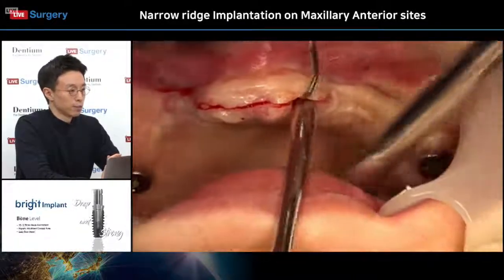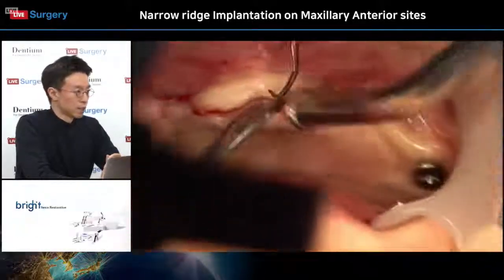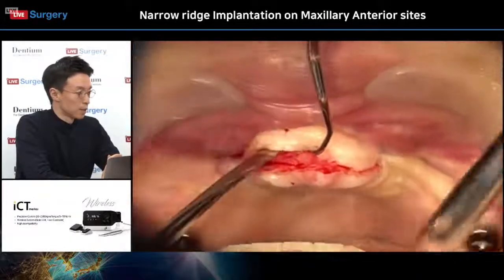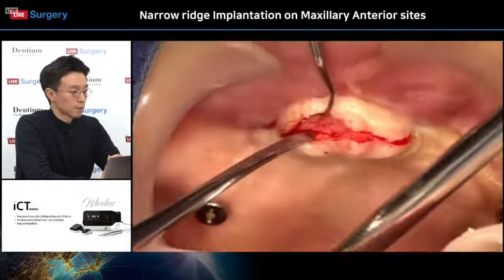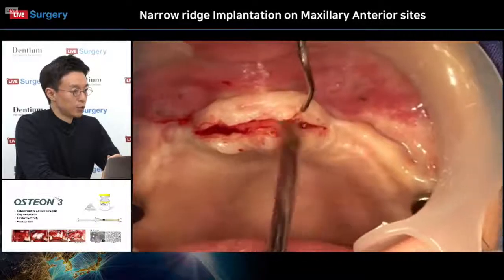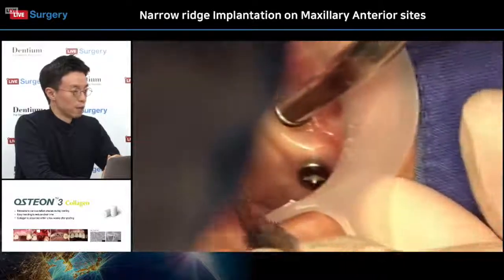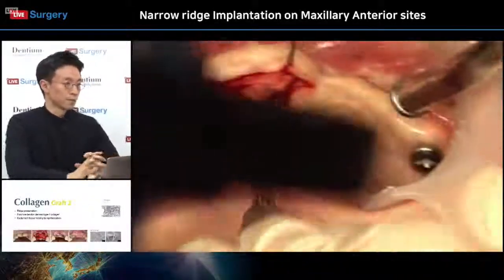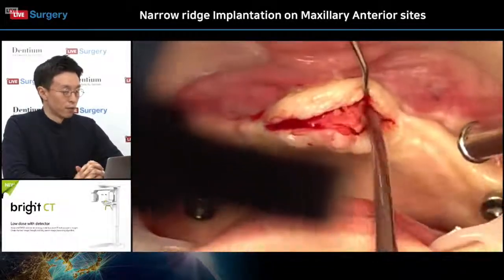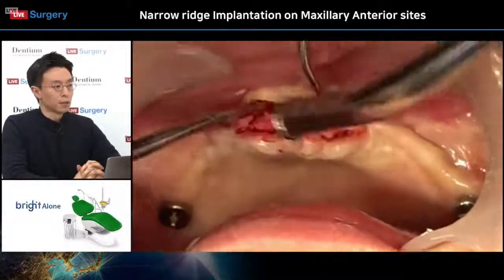He's cutting the periosteum definitively by using a periodontal probe and periosteal elevator. He is elevating the periosteum on both sides to identify the bone condition of the buccal, labial, and palatal sides. When we elevate the palatal side flap, we should be cautious of the incisive nasopalatine nerve.